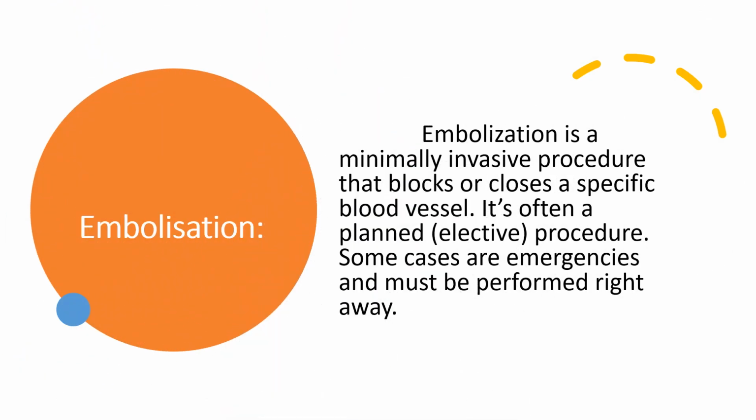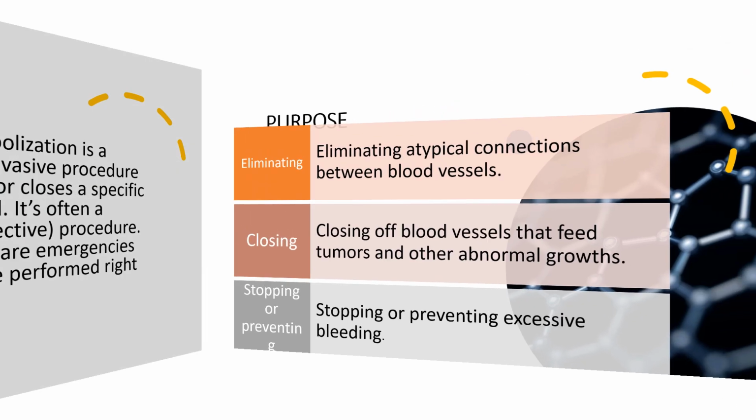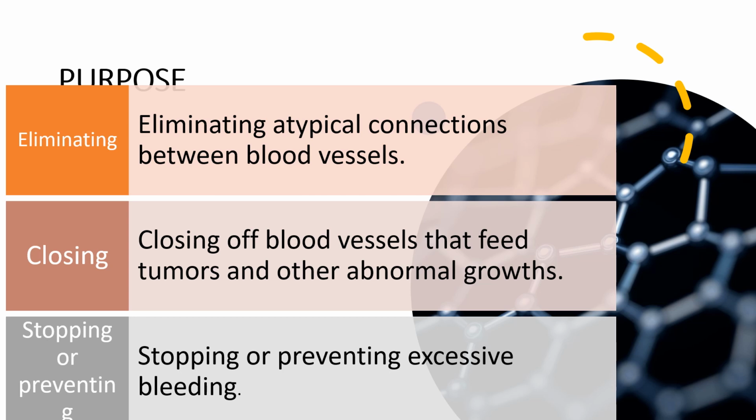So embolization is a minimally invasive procedure. It either helps to block or close specific blood vessels. The purpose is eliminating, closing, stopping or prevention. Eliminating atypical connections between blood vessels, closing any tumors and other abnormal growths, stopping or preventing excessive bleeding.